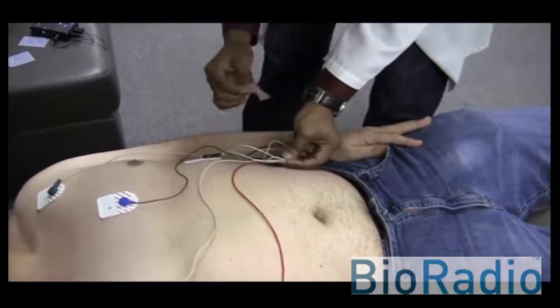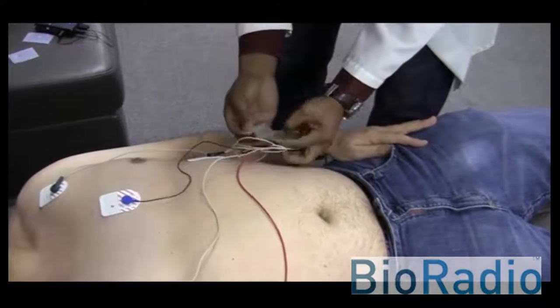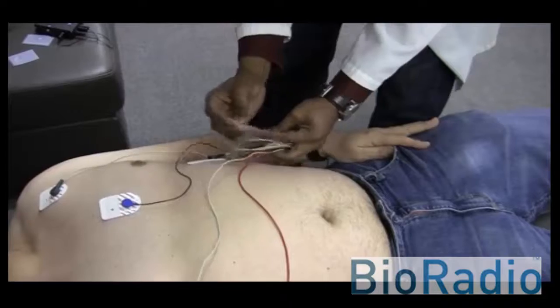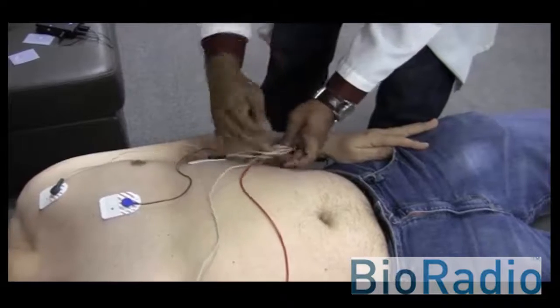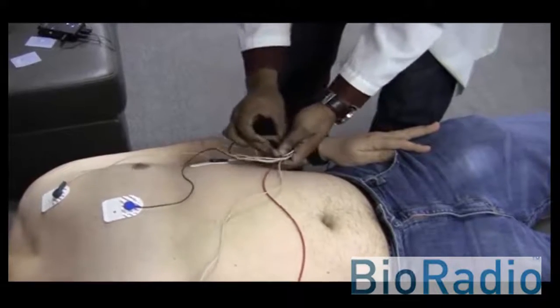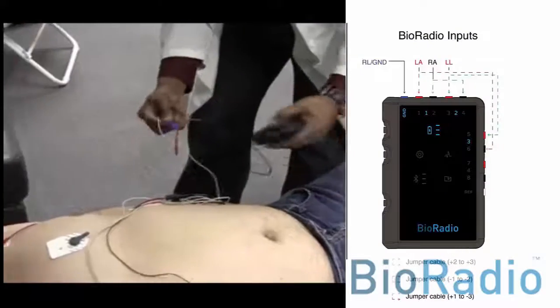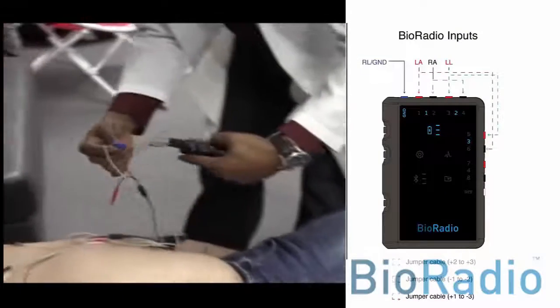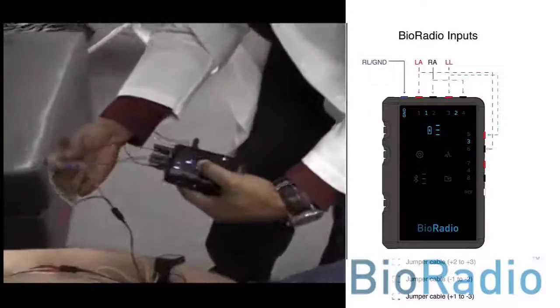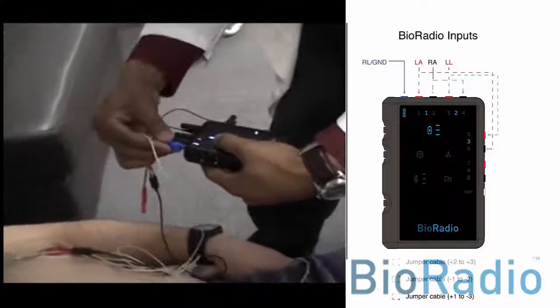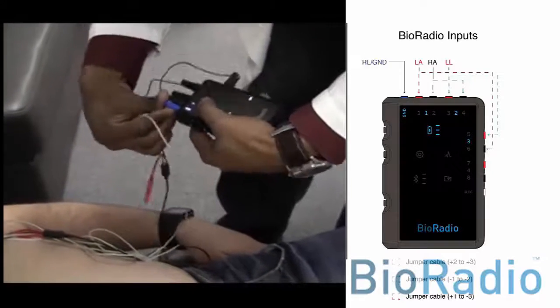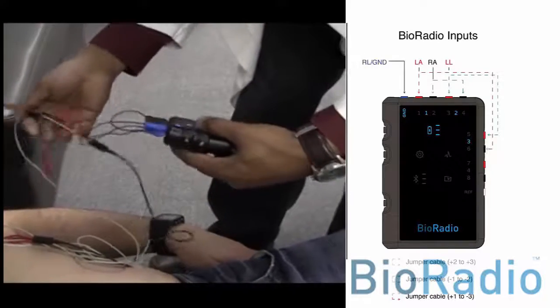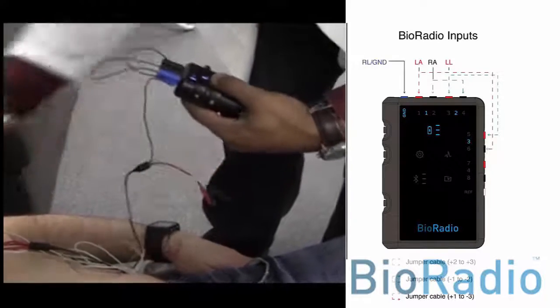The last step in setting up the BioRadio is attaching the leads with the proper configuration as shown in the diagram to the right.